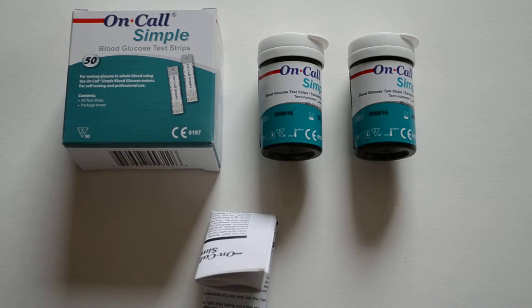The On-Call Simple meter system retails in the UK between £9 and £12 delivered, and these packs of On-Call Simple blood glucose test strips are delivered for between £6.50 and £12.50 per pack. Each pack contains 50 test strips.